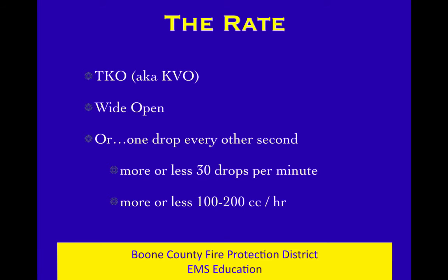Either way, whatever you want, it's a TKO, and that is dripping very slowly, and there's enough fluid running in, just enough, a very small amount, but just enough to keep the clot from forming in the IV catheter. It's just to keep that vein open. We're not trying to give any fluid through here. We're just trying to have it available if we need to give medications.